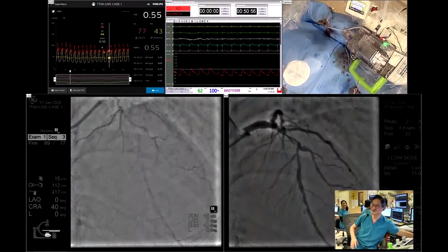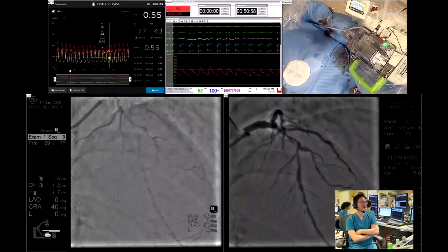So this is very, very different from what we usually see during live transmission. Correct.